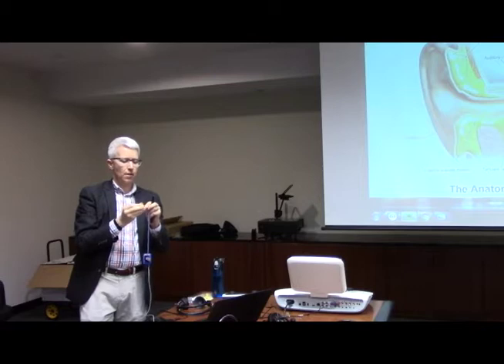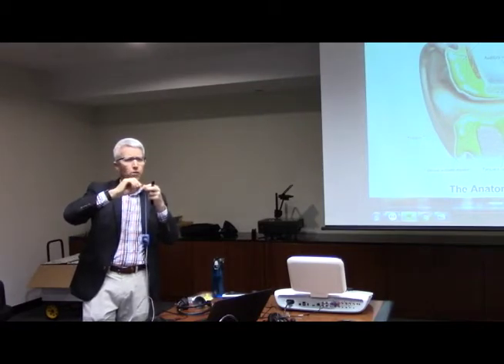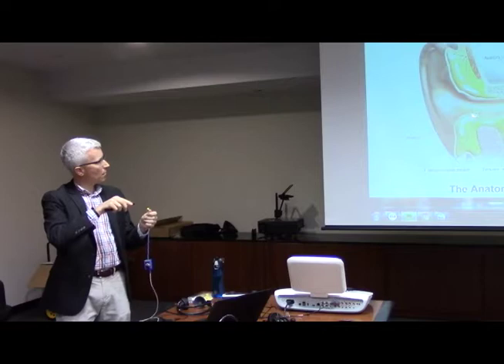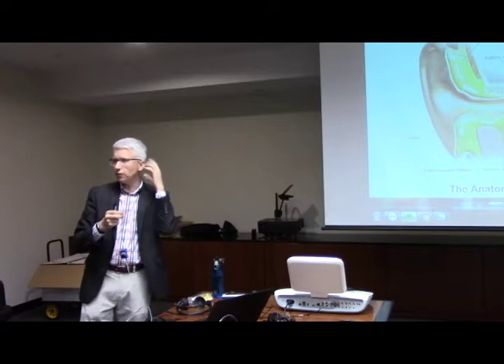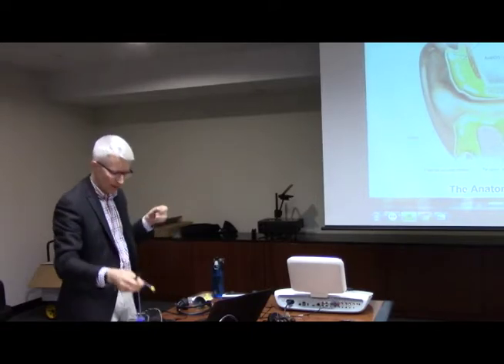So you roll it up real small. Anybody who's ever worn foam earplugs, this is basically what this is. You roll it up real small, you put it in the ear, and it actually goes into about right here and delivers the sound that way. So it's just another way of coupling the earphone to the ear so that the patient can hear it. And then they again respond every time they hear it.